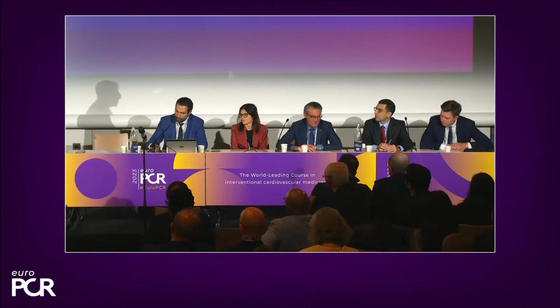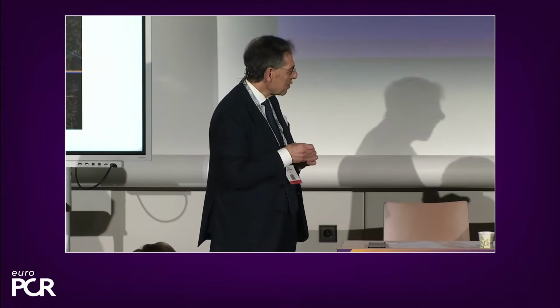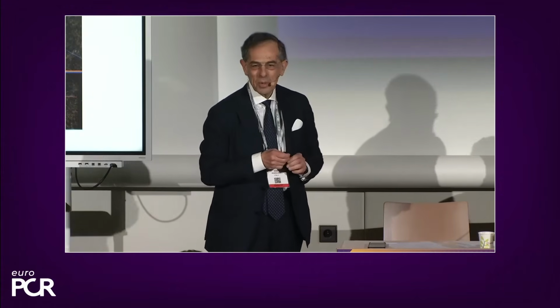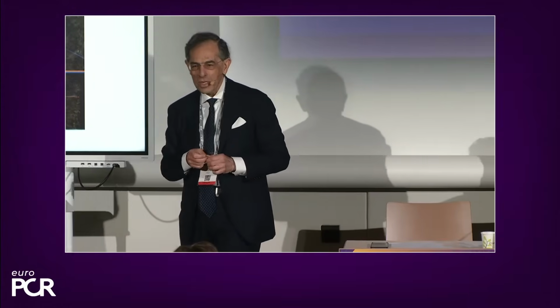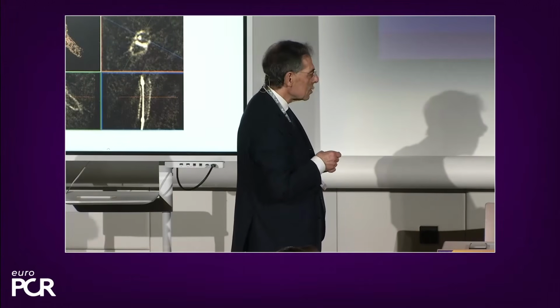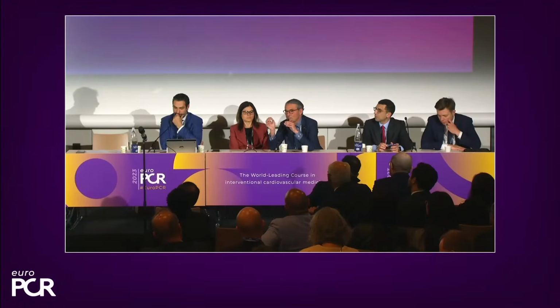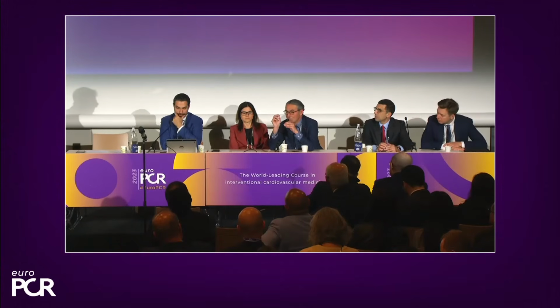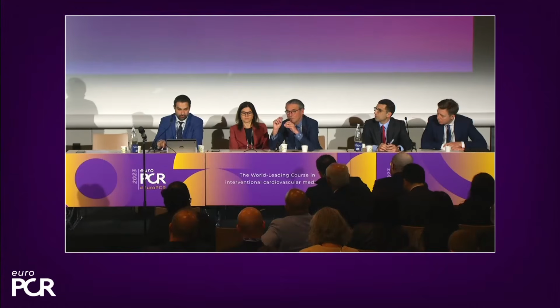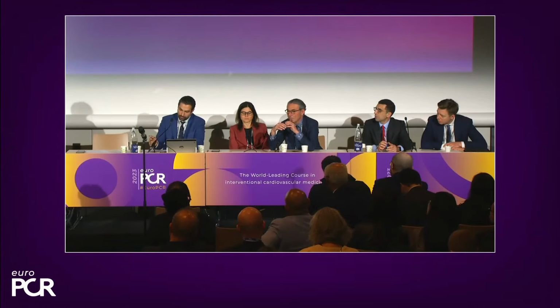Sorry. Left main. Everybody is talking about left main, and we know that the distal left main is still a problem compared to the surgeons. And so this could be a potential application for this technology, Hakim. Yes, of course. Regarding the left main, we need to have perfect results, and the impact of a non-expanded stent is influencing the prognosis of the patient.